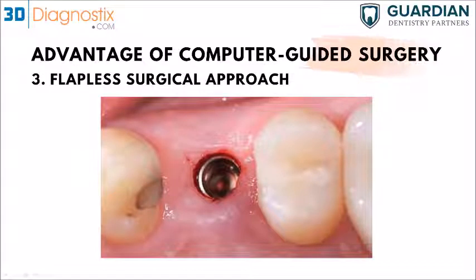So the reason why we recommend flattening the site before or just after placing the implant is if the implant is too deep in the bone because of a defect present, or there's some vertical bone loss on one of the sides. Then we recommend flattening the bone because it's going to be easier to place the abutment, because sometimes the abutment binds up with bone mesiodistally or, for example, on the buccal or the lingual if there's vertical bone loss on one of the sides.